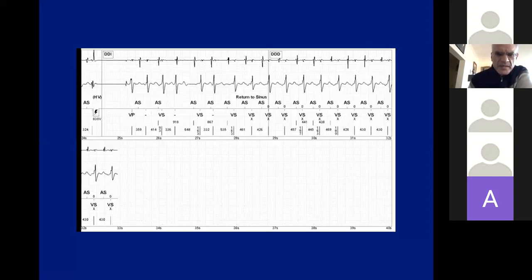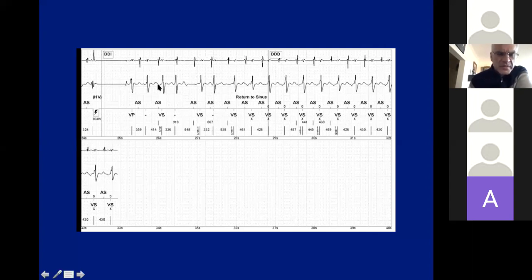This is the end of this episode — the device shocked it. There is a high-voltage shock that terminated it. Of course, it would terminate SVT as well.